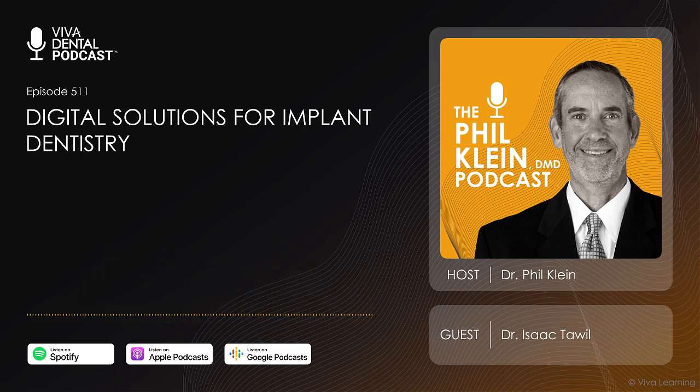And we're getting to that point around implants as well, which is really great because let's say we even if we don't want to make a final restoration, but we don't want to charge as a final restoration, it's nice to know that we can reprint something in a matter of an hour. So if a prosthetic breaks, we can just have another one made, or we can have a few copies of them, because the printing is so much more affordable than milling when it comes to these materials.